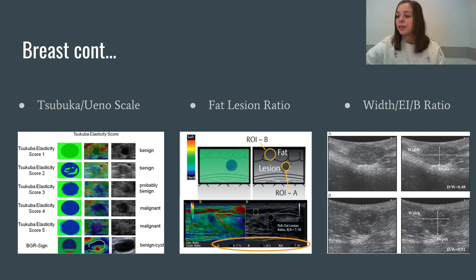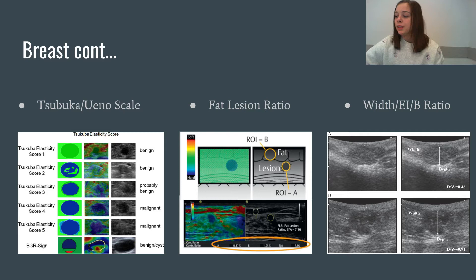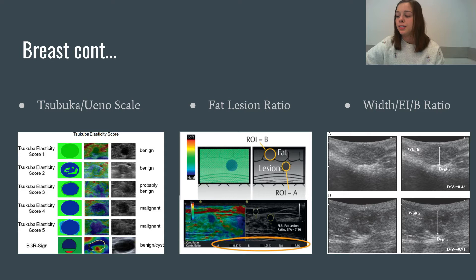Around score three is when it is more difficult to make a distinction between benign and malignant cysts — it is most likely benign, but you cannot be 100% sure without a biopsy. We can also use the fat lesion ratio to determine breast lesions. This is when a region of interest is placed within a lesion and a reference area is placed in surrounding fat tissue. It is necessary for both of these regions to be at the same depth. We should avoid placing the region of interest near blood vessels since the movement of blood can produce artificial effects of displacement, therefore affecting our ratio and creating the possibility for inaccurate results.